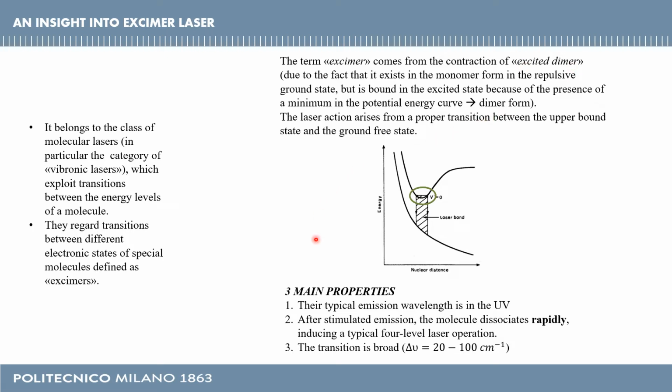So, if we suppose that in our generic material volume a large amount of excimers is produced, we can have laser action under proper conditions between the upper bound state and the ground free state, the lower free state.